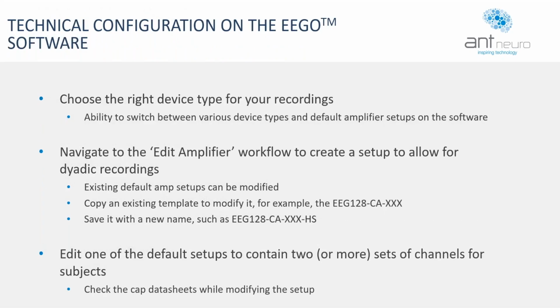This brings me to my next slide, because now we've covered the application schematic or the hardware components, but there's also on the software side maybe a question of how dyadic recordings will be accommodated by the Eego software. And here I think it's nice to mention that the Eego software, both with our hardware and our software, we want to allow complete modularity and flexibility for the recordings and for subjects.